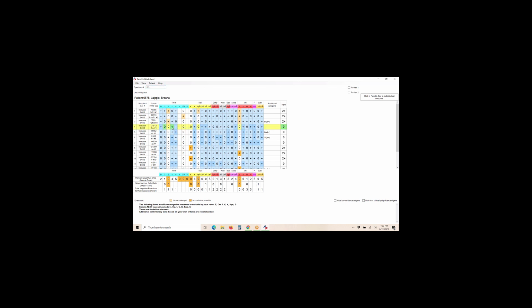And it is little c and little e positive, and it's negative for big C and big E. So that tells us, theoretically, 99.9%, I don't know if there are very many exceptions to that, that's an F positive cell. So we can tell, based on our phenotype, here's another one that would be negative because little r. We can tell the F is excluded.